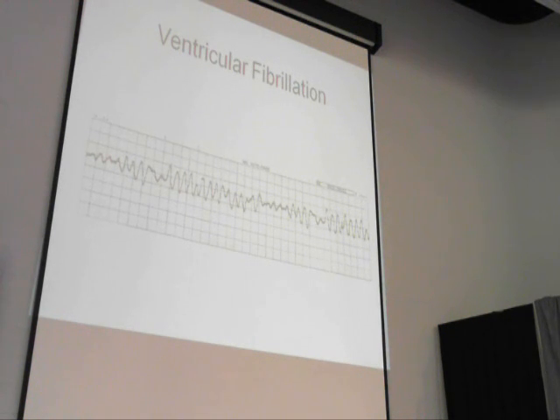The quicker you get the defibrillator there, the better. And even then, the prognosis is not too good. The goal is to deliver a high enough amount of electricity to override the irregular electricity, the chaos that's there, and let normal take over.